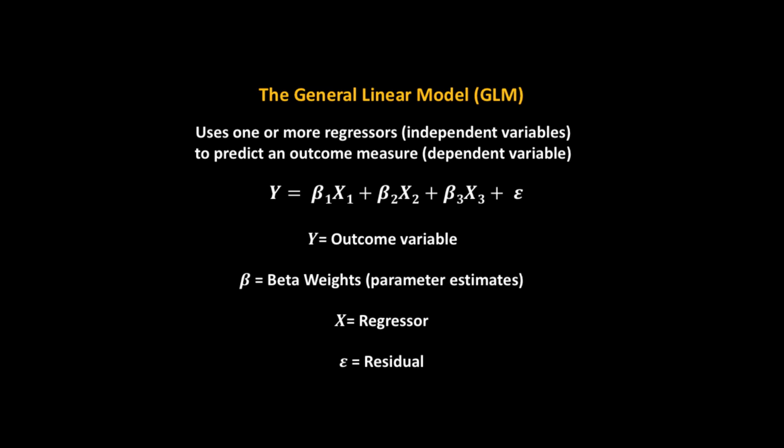Anything that we can't explain in the time course by any of these explanatory variables goes into this error term. And the bigger this is, the weaker our statistical results are going to be. That's why we try to model every possible thing that we think may be affecting the actual signal. Right? So any button they pushed, anything that they saw or heard during the experiment, we try to model all that to best explain the variability in the signal. Anything left over gets shoveled into a residual term.